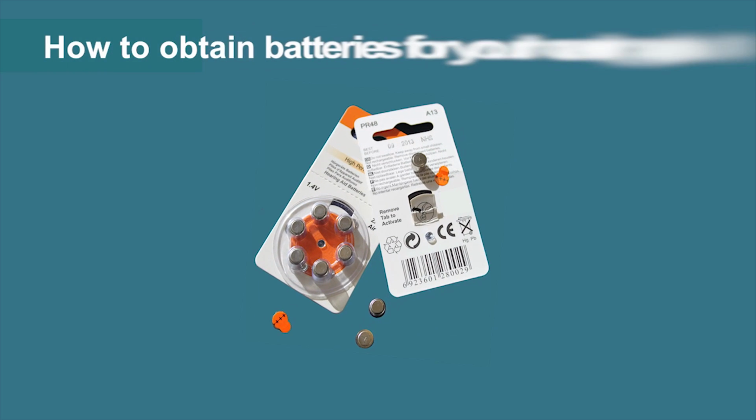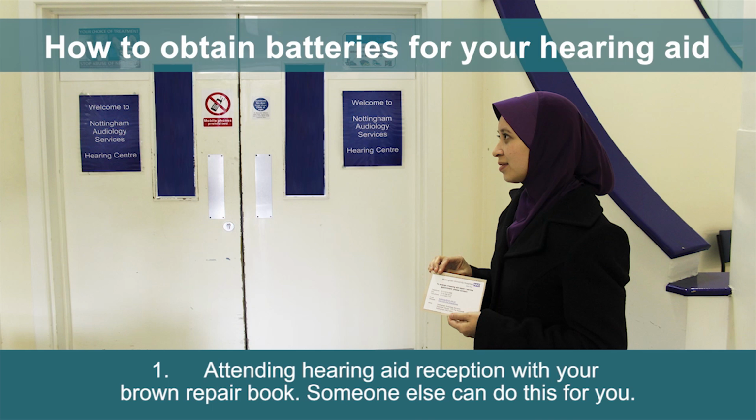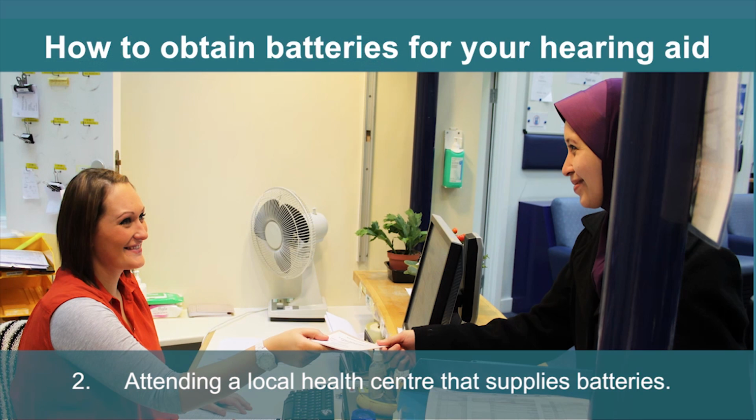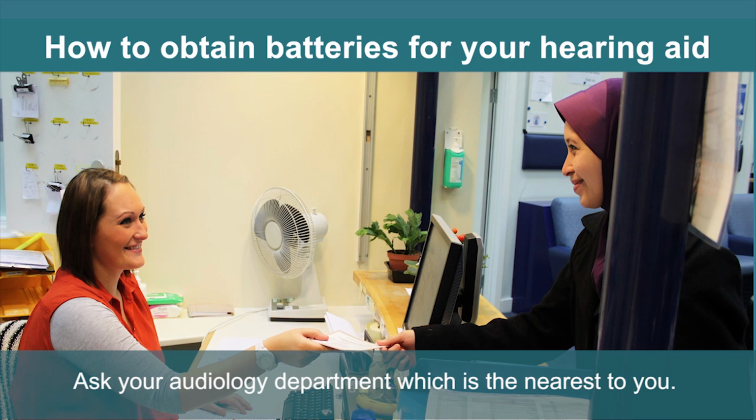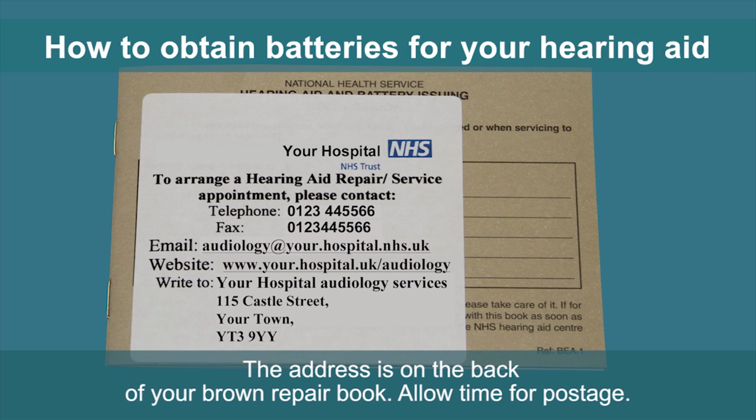How to obtain batteries for your hearing aid. You can obtain your batteries at no charge from your audiology service by 1. Attending hearing aid reception with your brown repair book. Someone else can do this for you. 2. Attending a local health centre that supplies batteries. Ask your audiology department which is the nearest to you. Or by 3. Posting your repair book to the audiology service, requesting batteries to be posted out to you. The address is on the back of your brown repair book. Allow time for postage.